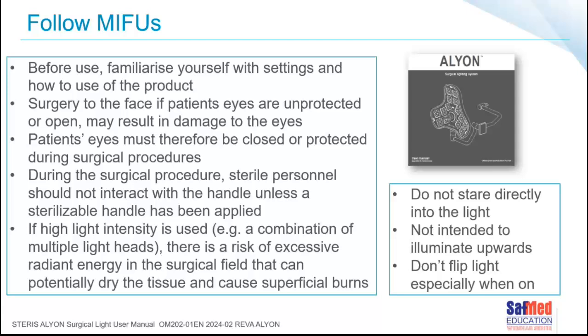They also go on to remind us not to stare directly into the light, and that these lights are not intended to illuminate upwards, and don't flip a light, especially when it's on. I don't know why, but I used to like flipping the lights up to create this lovely ambiance under certain circumstances, and I recently learned that I shouldn't do that. So please be cautious about flipping your lights up. Really not ideal for the surgical light.